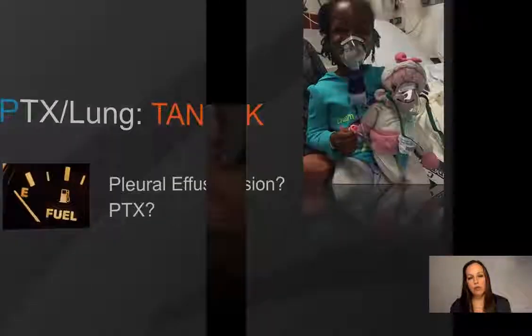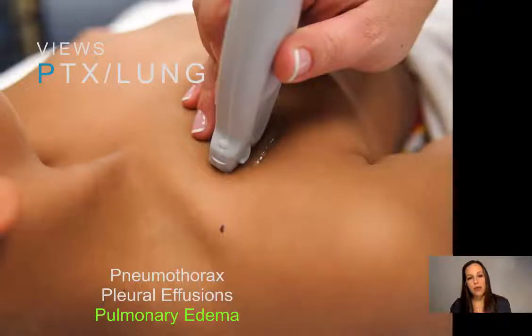So pneumothorax, we're looking at the anterior chest. We're doing a quick screening and we're looking for air. We're looking for the absence of pleural sliding. Other things that we can see on the lung views, now these aren't traditionally part of the original RUSH protocol, but pulmonary pathology is particularly important in pediatric patients. So we can look for other things, including pleural effusions and pulmonary edema.